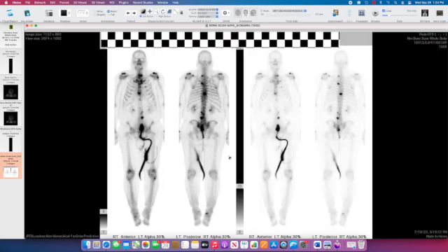In this patient there's a history of prostate cancer and they're looking for bone metastases. This technetium MDP radiotracer is basically taken up at sites of bone turnover. Because prostate is an osteoblastic process, when it metastasizes to the bone those foci would typically be hot or intense on a bone scan.